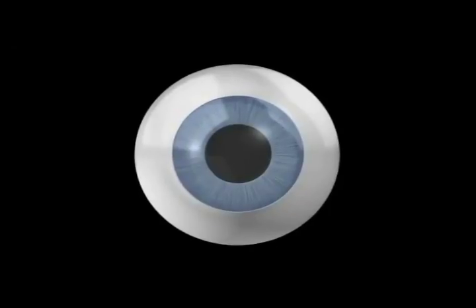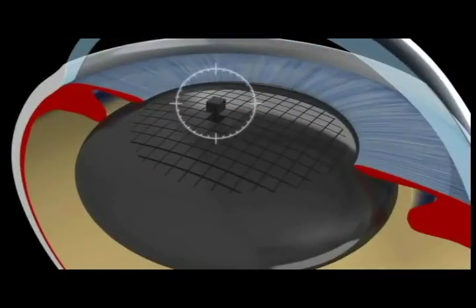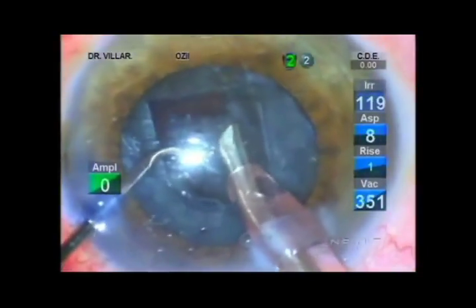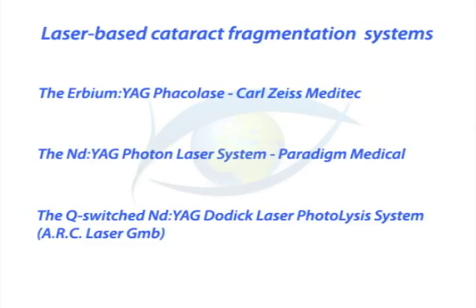The femtosecond laser also offers laser cataract fragmentation by performing linear cuts. The laser separates the cataract into tiny pieces that can then be more easily removed by ultrasound phacoemulsification. However, femtosecond laser fragmentation can be used only in soft cataract, and we still need to use ultrasound for cataract removal in hard cataract. In the last 20 years, some surgeons tried to use laser for fragmentation of cataract, but these technologies had common disadvantages. They can only remove soft cataract, and for that reason they didn't find wide use in practice.